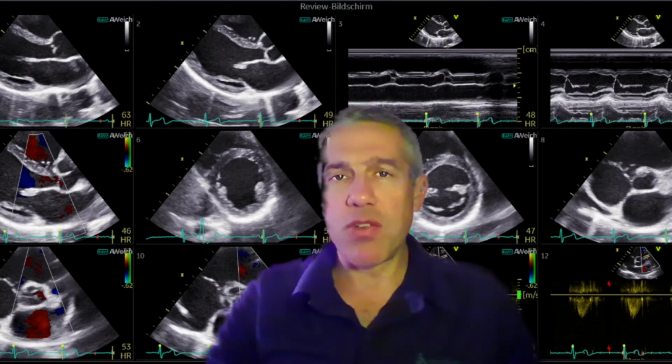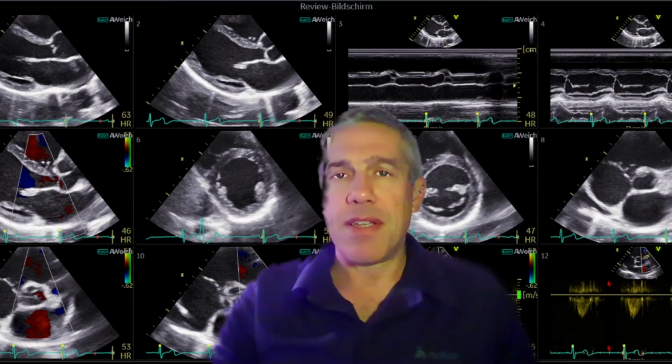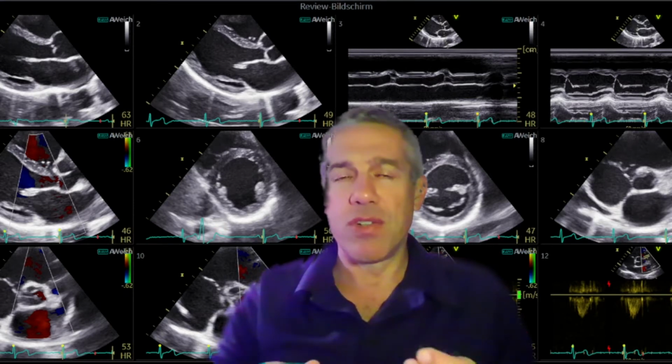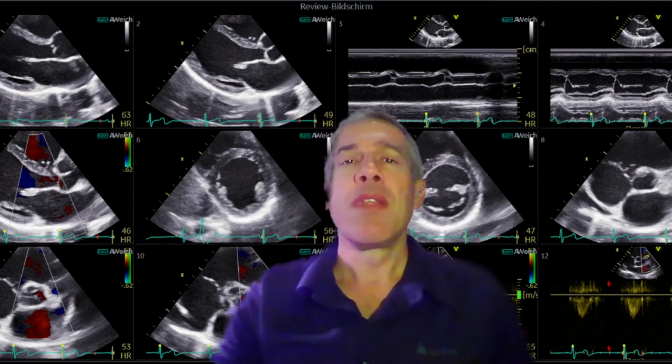This patient is not my own patient, so I just saw him on the echo table, and we had a programmer from Boston Scientific to program the device to different settings. We scanned him in his own intrinsic conduction, and that was in left bundle branch block, as I was told. I haven't seen the ECG.